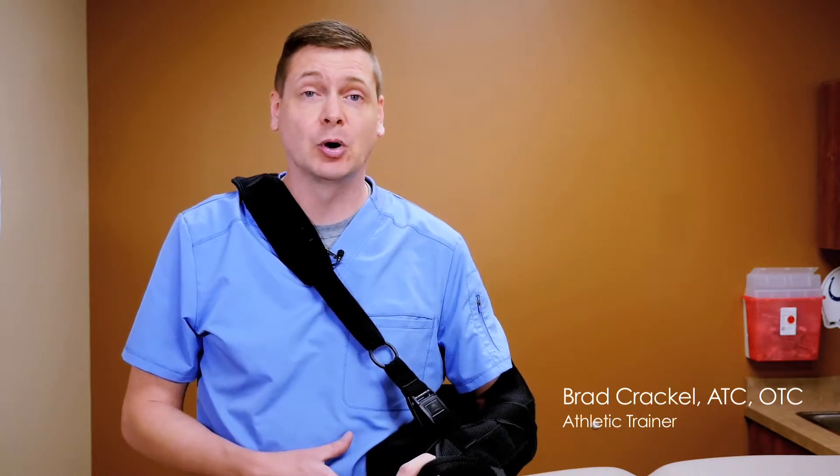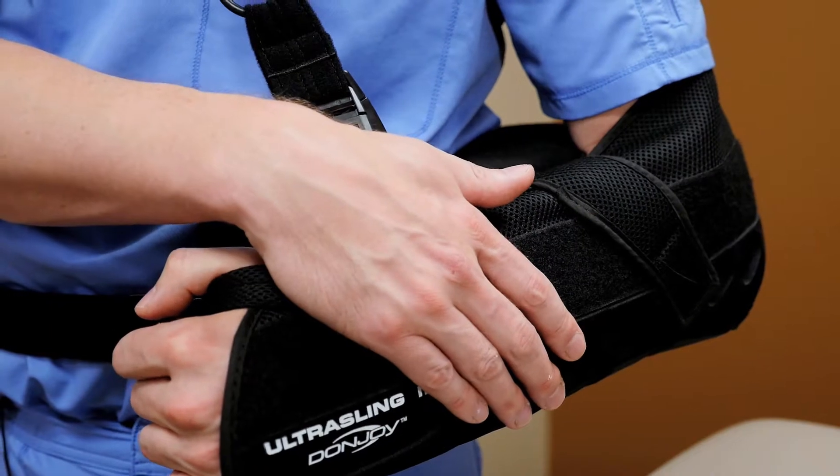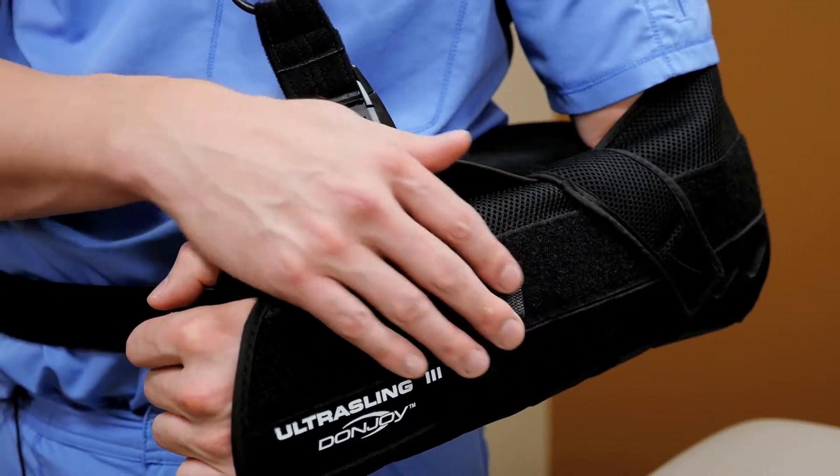The first thing we'll do is actually show you the proper position of the immobilizer. Ideally we want your elbow at a 90 degree angle with your upper arm and the pillow right at your side. So if everything looks good in that respect, we can now take off the immobilizer.